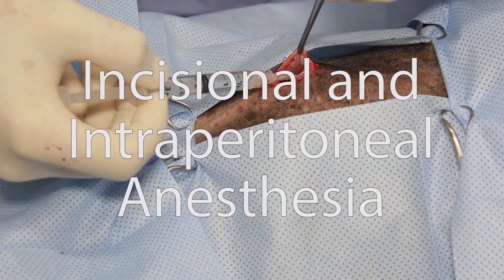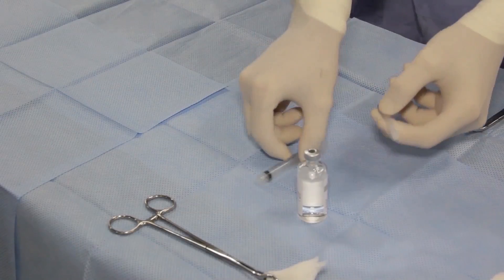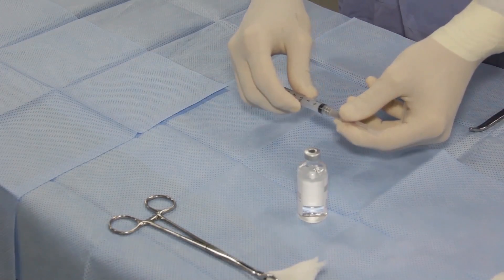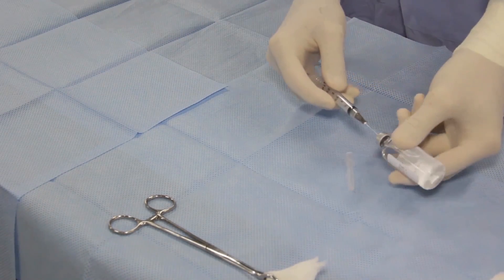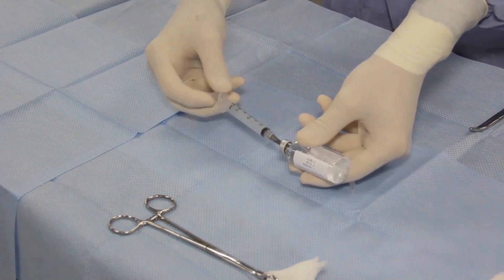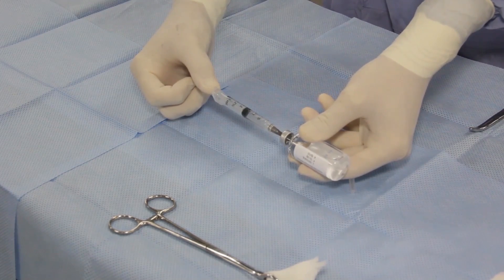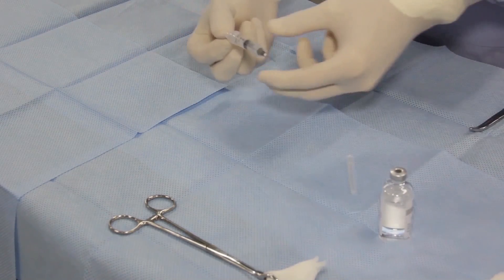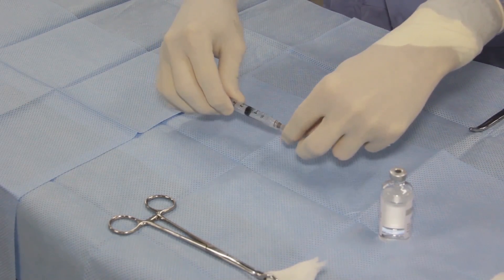Incisional and intraperitoneal anesthesia. When performing an incisional or intraperitoneal block, the surgeon will prepare a syringe of local anesthetic in a sterile manner. The maximum doses of local anesthetics are calculated. The need to perform additional local or regional blocks should be taken into consideration. For example, one may want to use both an incisional and intraperitoneal anesthesia in a dog undergoing an ovarian hysterectomy.